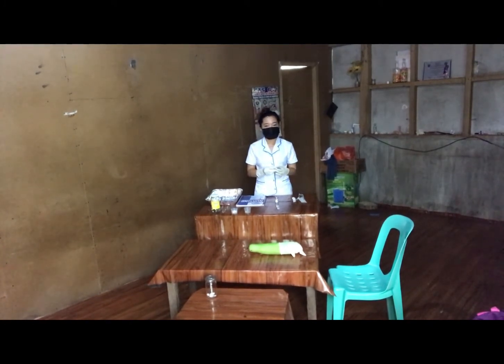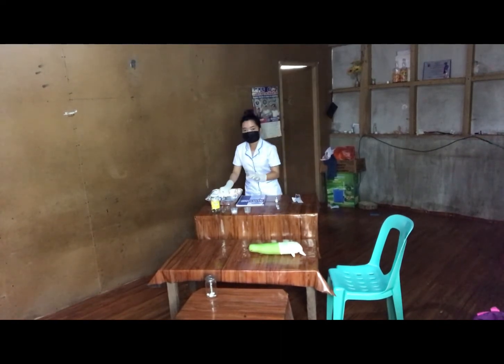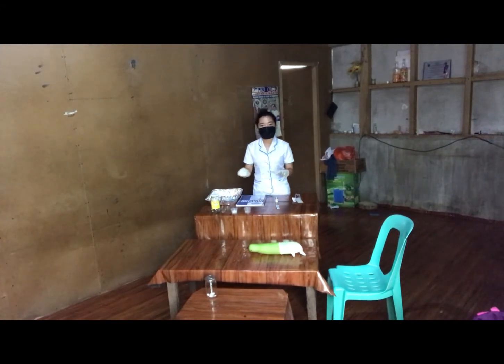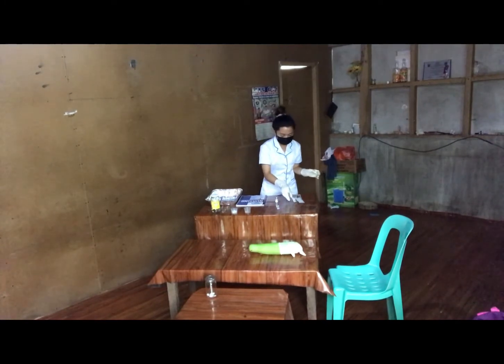So now I will place it in the hypodermic tray. So this. And the aspiration needle is into this receptacle. So I will throw this into the bin.